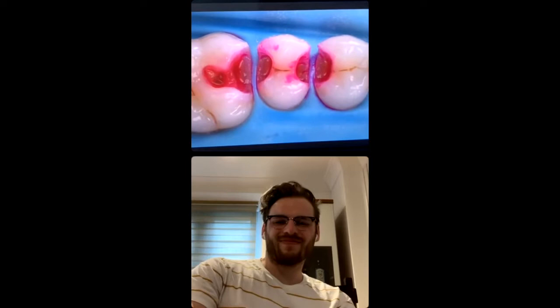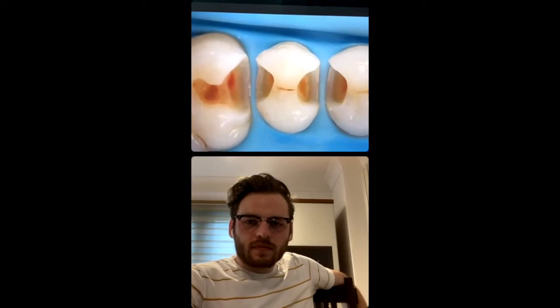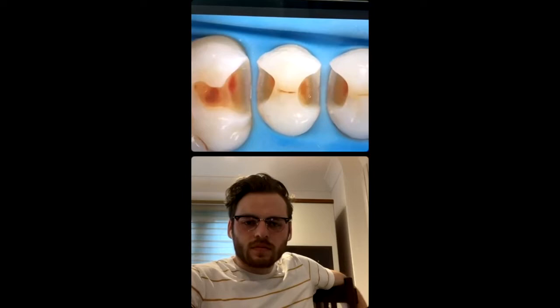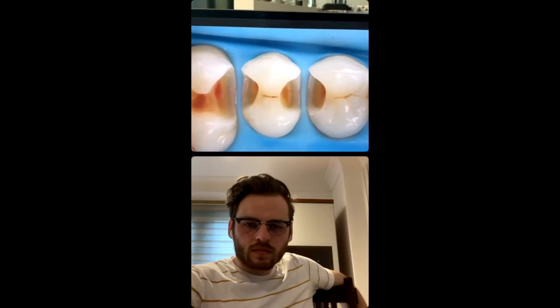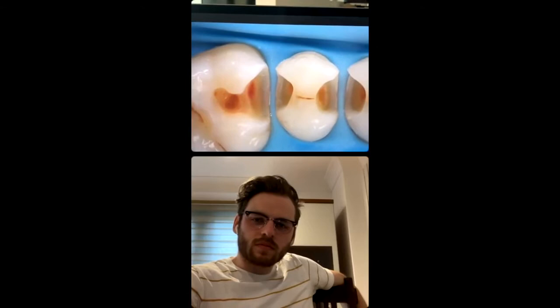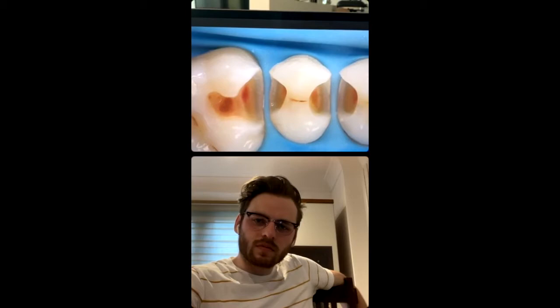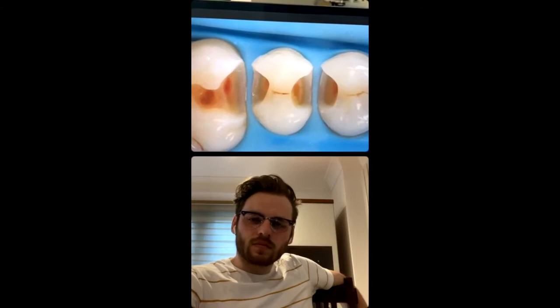This also looks quite cool in films — you can't miss that. So that's after my caries removal — that's my caries removal endpoint. I've got my two-millimeter clean peripheral seal zone. You've got your clean dentine and then you've got caries which is left, but it's fine because it's going to be all sealed in. Something as well as C-factor: you need to try and make your preps as wide as possible — sort of widen out to reduce the C-factor. I use a red flame-shaped burr to pull these areas out, or a coarse disc to smooth them. Because if you've got a really tight area you've got a really high C-factor, and you want to widen out as much as possible to reduce the risk of contracting and pulling off the walls.